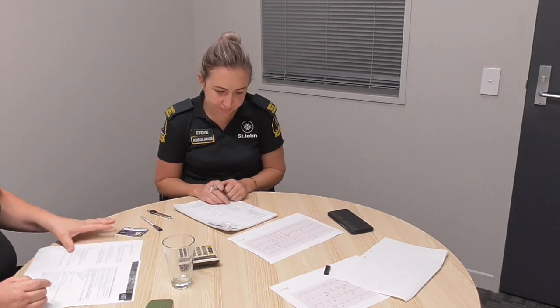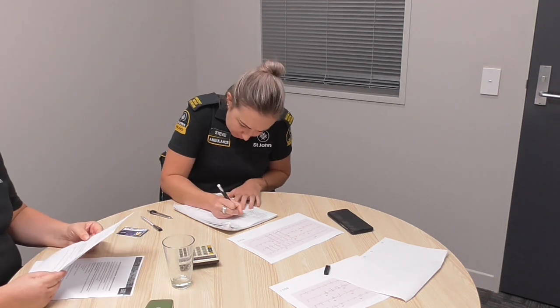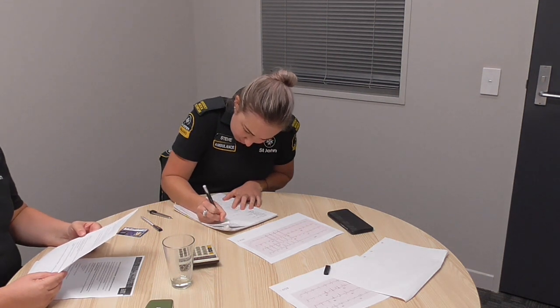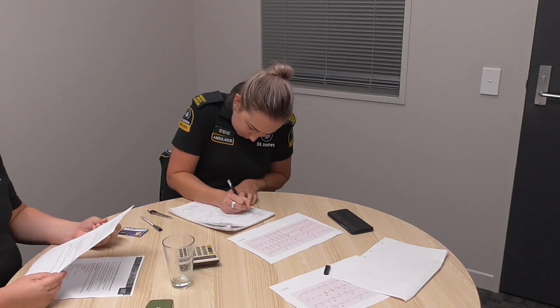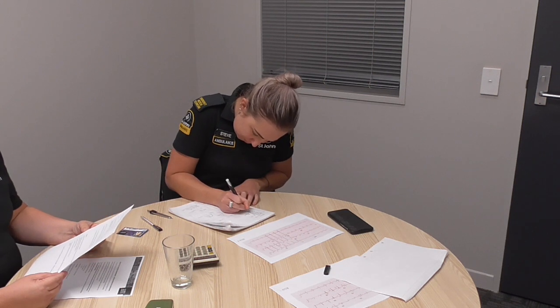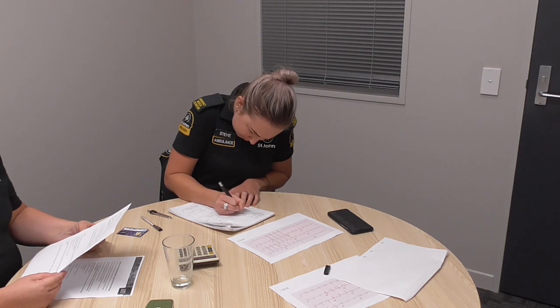ECG 2. Okay, so this is a 32-year-old female who is short of breath, status 2. History is she's a brittle asthmatic with ICU admission 2 years ago. Mitral valve repair as a child, secondary to acute rheumatic fever.